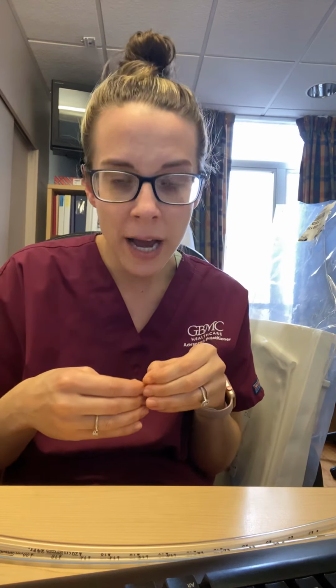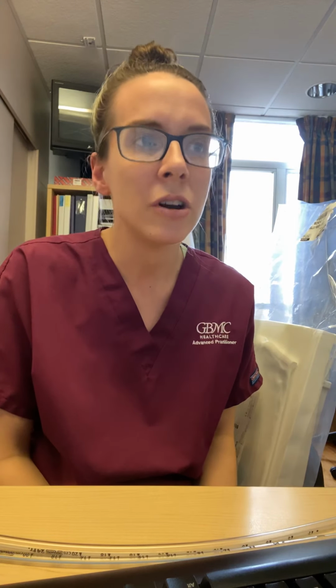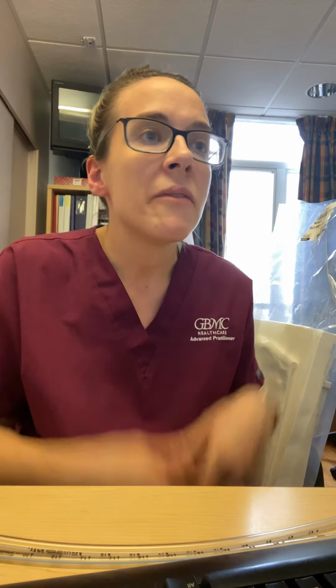So you always want to check for evidence of an air leak by having the patient take a few deep breaths, just to get the lungs nice and expanded, and then have them cough. That really helps to evaluate for the presence of an air leak or not in that water seal chamber. And then in the final chamber, you have your suction control.